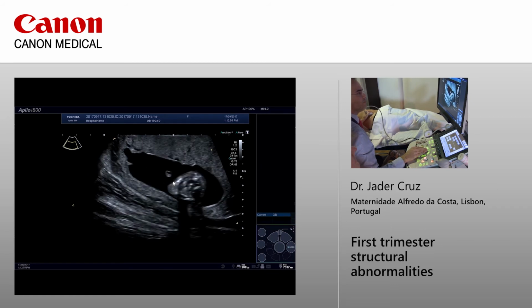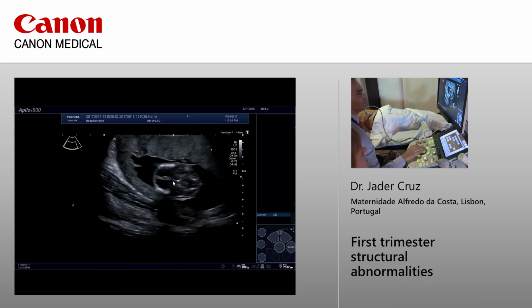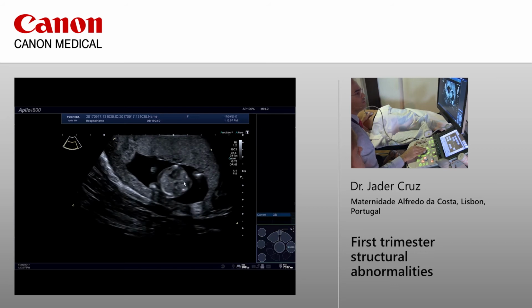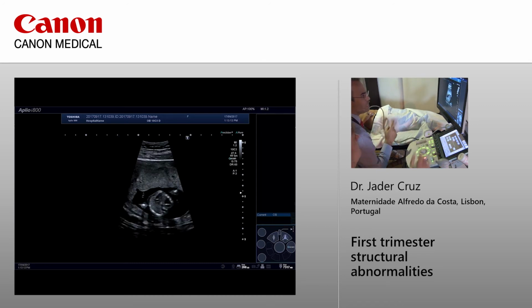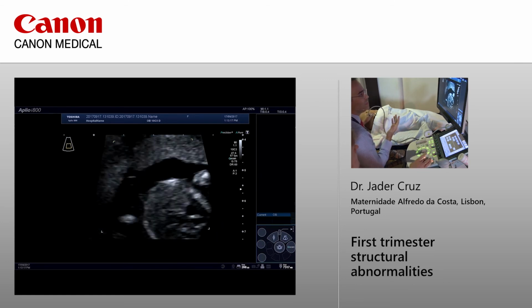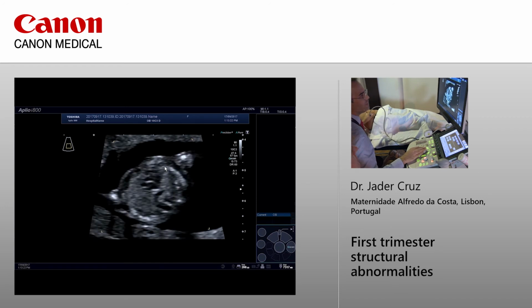Yeah, so we move that, and we come back there later if the baby truly helps. Then we go there to the thorax. You see lungs. You see the heart. We can move to the heart now. The heart is the only thing that makes me change everything, because if the heart is in the good position, you cannot actually lose the chance of looking at the heart. And then we see there everything that we should see.